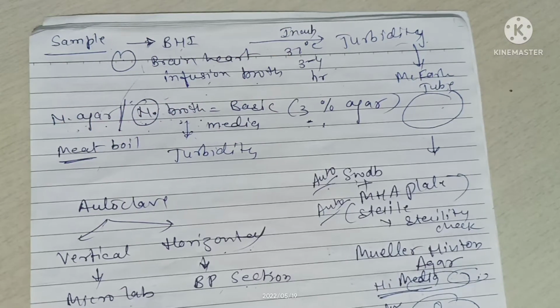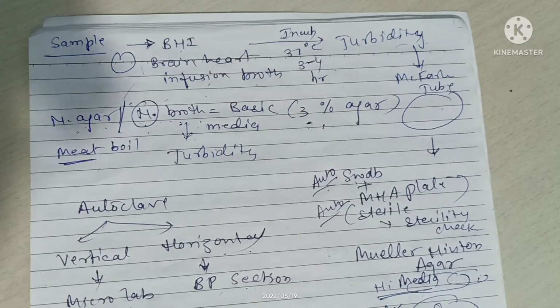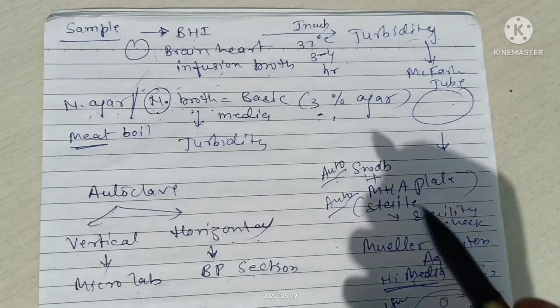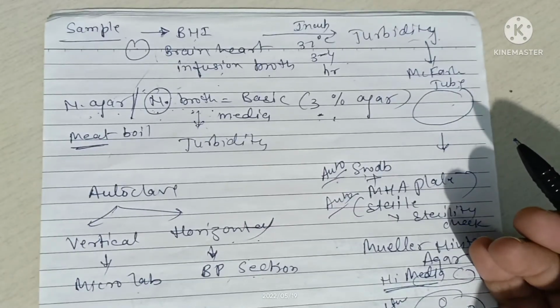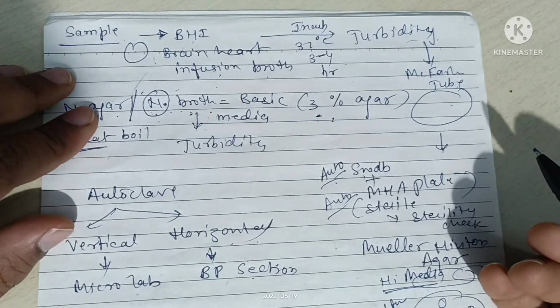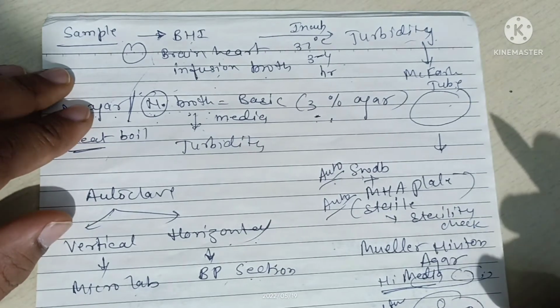Hello friends, today I am going to discuss the antibiotic sensitivity test. The antibiotic sensitivity test is also known as the antimicrobial sensitivity test or ABST. Why is the ABST to be conducted? I am going to tell you about the detailed procedure of the ABST.